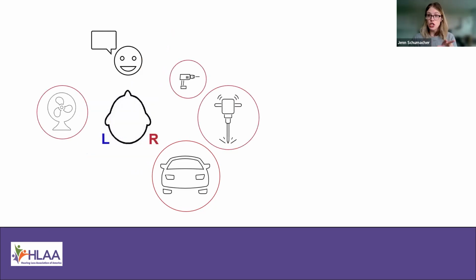Now, let's say the situation changes slightly. Now we've added in more noise. We've got not just traffic noise behind this person on the right, but now we've also got some construction noise, some machine noise, and then on the left, we have this fan running in the background. So these are all sources of background noise that would definitely interfere with trying to understand someone talking to you.